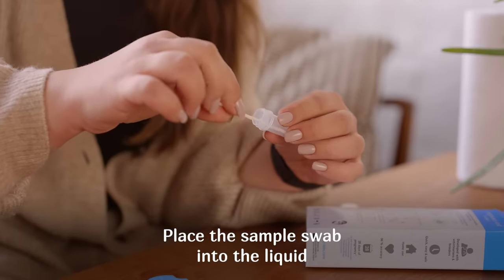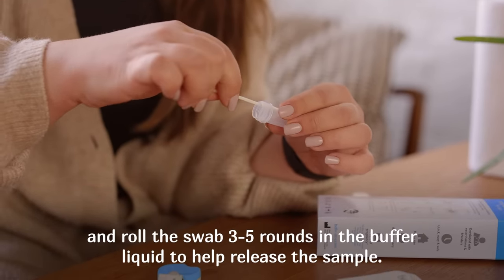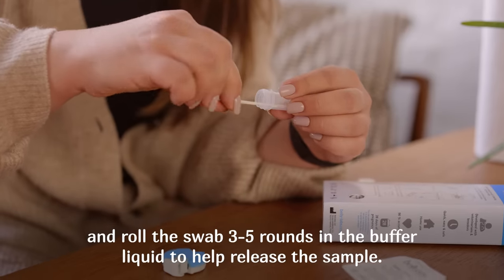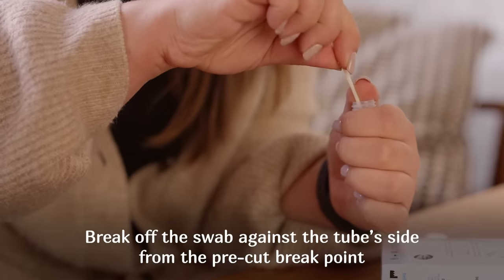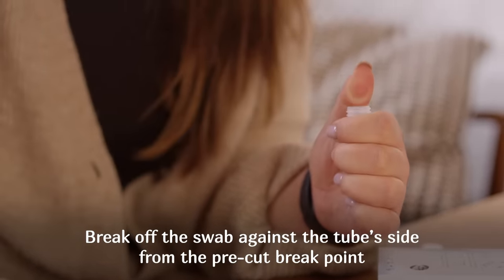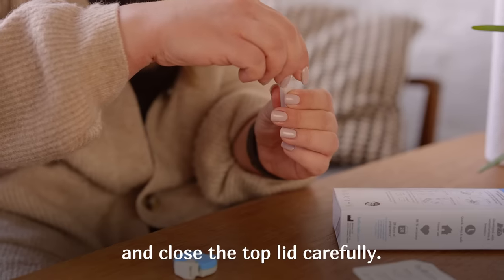Place the sample swab into the liquid and roll the swab three to five rounds in the buffer liquid to help release the sample. Break off the swab against the tube's side from the pre-cut breakpoint and close the top lid carefully.